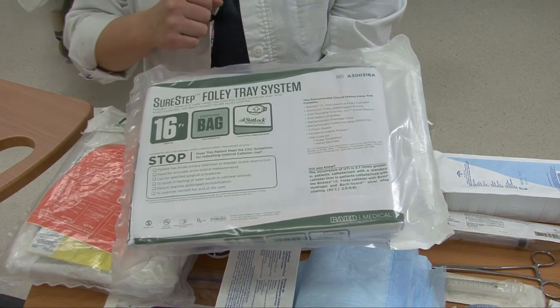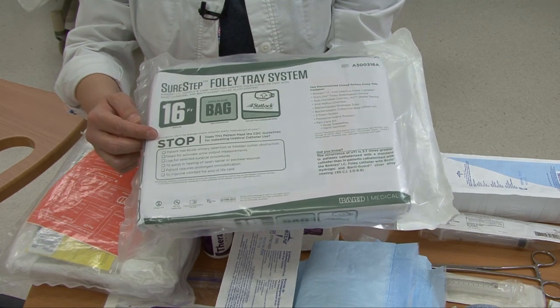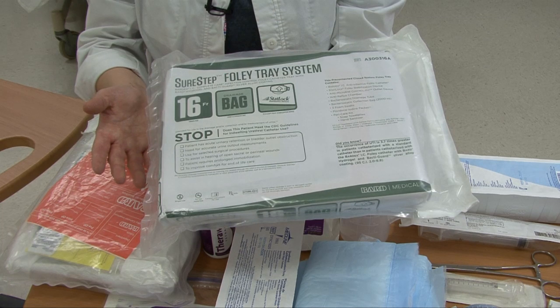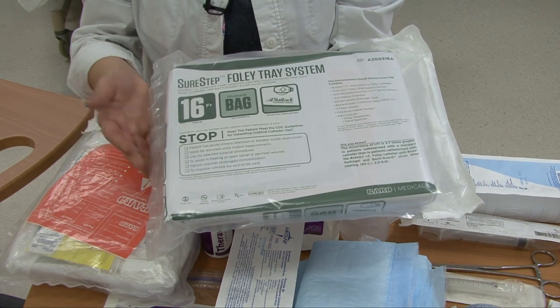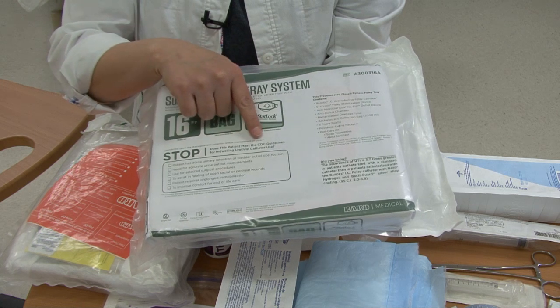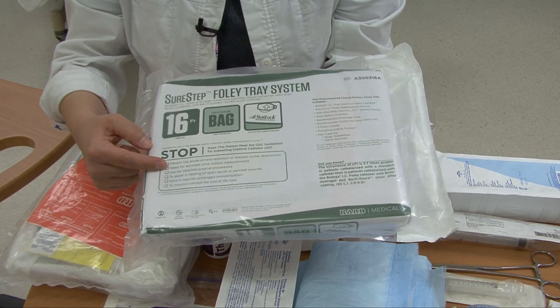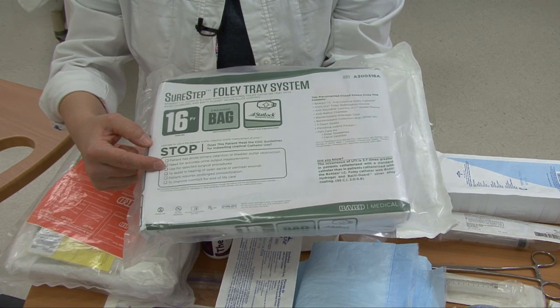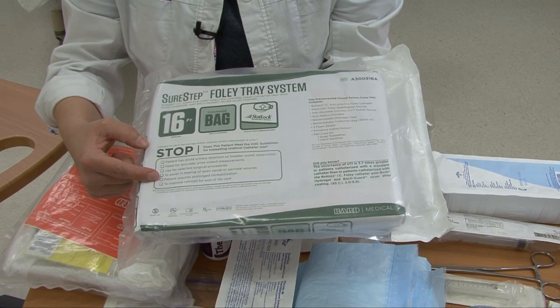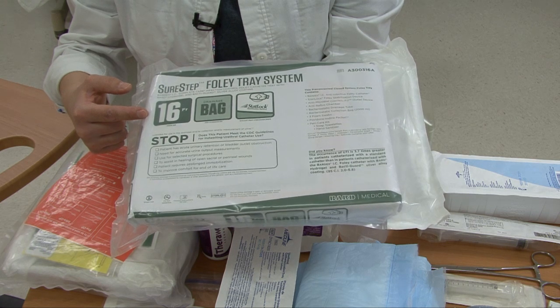You always want to know the reason the doctor ordered the catheter, because they might have put the order in on the wrong patient. You also need to be able to talk to your patient about the reason for the Foley catheter. The package asks: does your patient meet the CDC guidelines for indwelling urethral catheter use? Indications listed include acute urinary retention or bladder outlet obstruction, need for accurate urine output measurements, selected surgical procedures, assisting healing of open sacral or perineal wounds, prolonged immobilization, and improving comfort for end-of-life care.